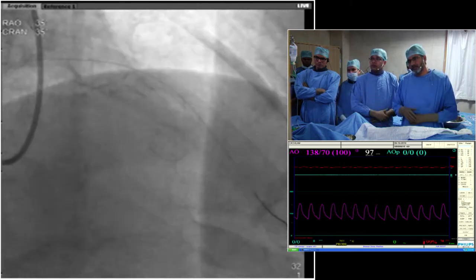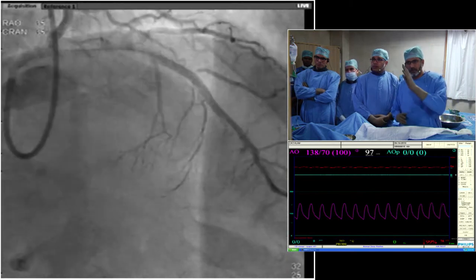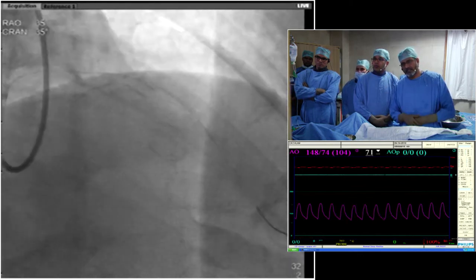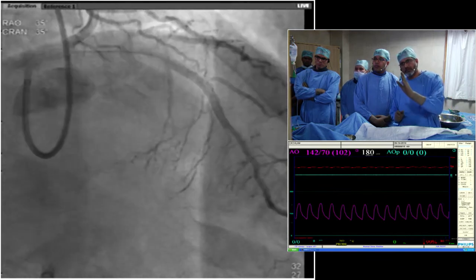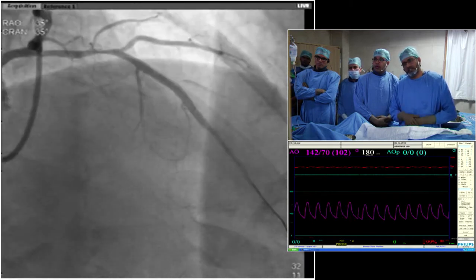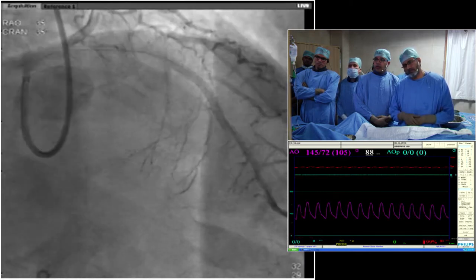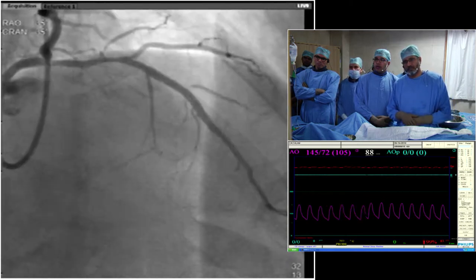What I would like to do is go ahead and put a stent from the distal left main, probably mid shaft of the left main, up to the diagonal. Just leave that segment between the diagonal and the septal, which has very mild disease. So not going to overlap the stent, and put a stent from the distal left main up to the diagonal, and then optimize the result, then do an OCT and see if there's any significant plaque shift into the LCX, and do a kissing balloon angioplasty.